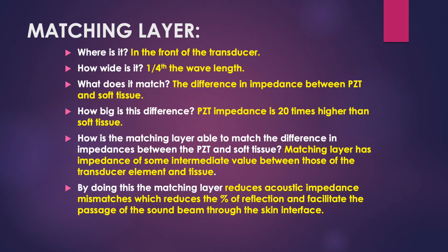Where is the matching layer? In front of the transducer. How wide is the matching layer? 1/4 the wavelength. What does the matching layer match? The difference in impedance between PZT and soft tissue. How big is this difference? PZT impedance is 20 times higher than that of soft tissue.